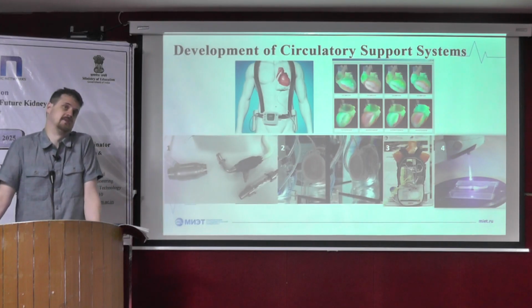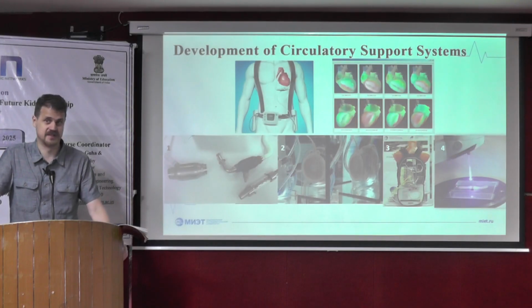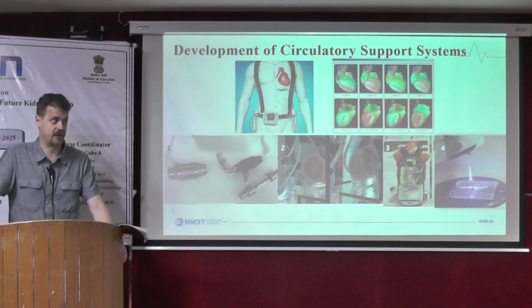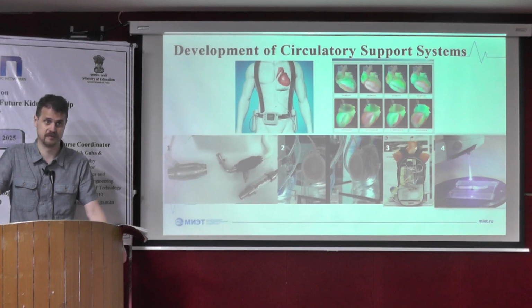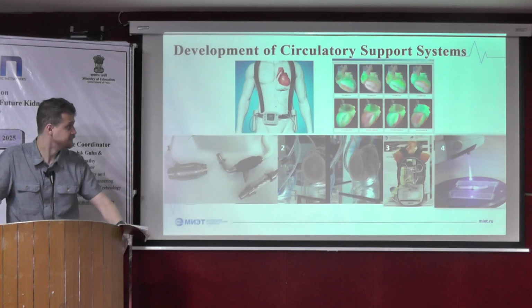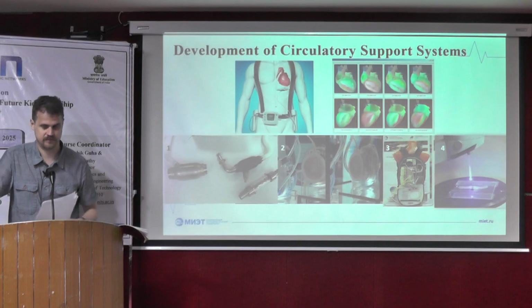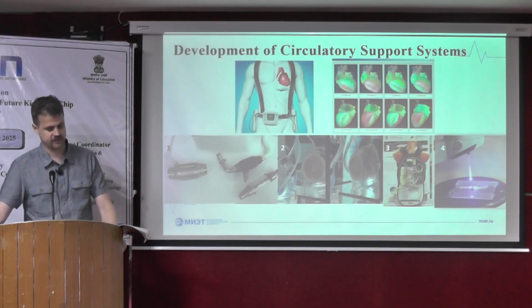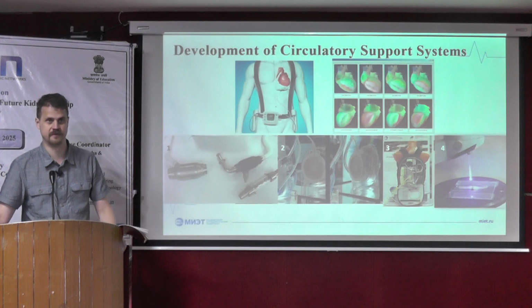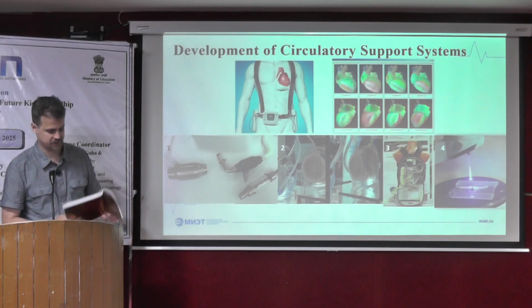Considering the fact that when we talk about the implantable artificial kidney, we basically have the same issue as the artificial heart, because we have to consider the blood clotting in the system, and we have to develop the measures how to prevent the blood clotting on the internal surface of the apparatus. So, speaking of the different approaches, the most obvious but not very desirable approach would be the heparin infusion. The long-term heparin infusion can lead to different issues with the patient's health.